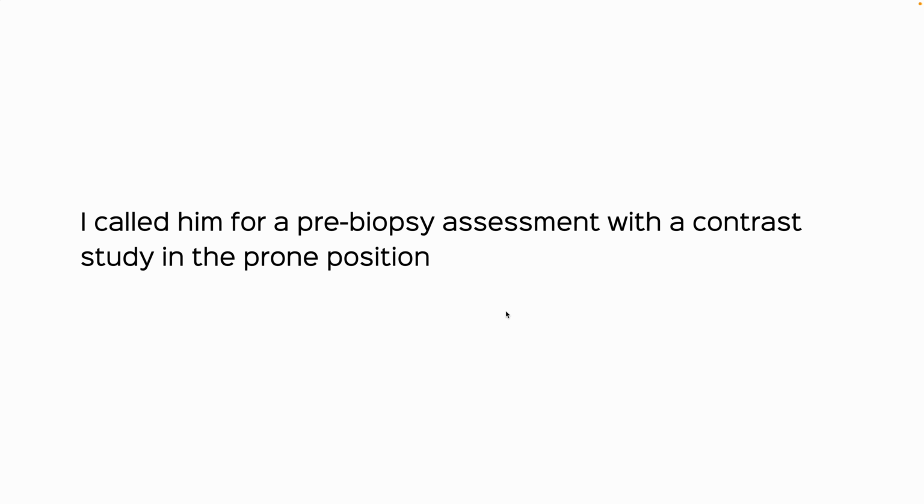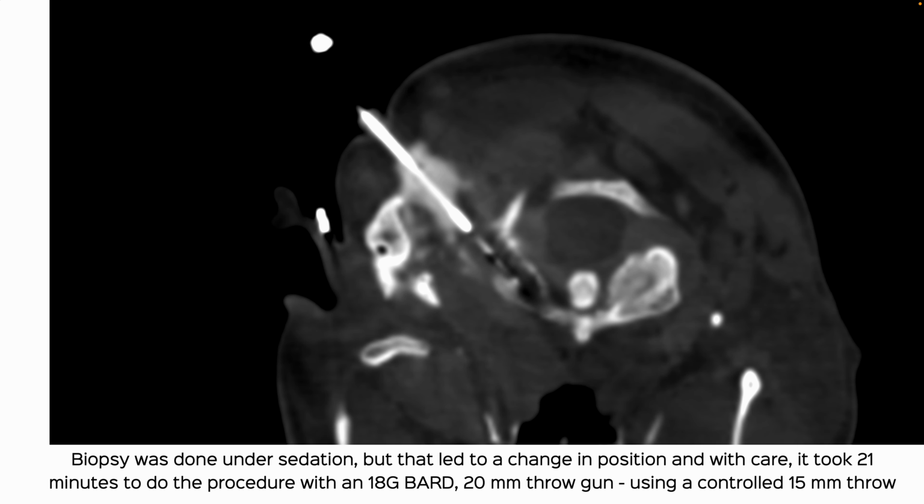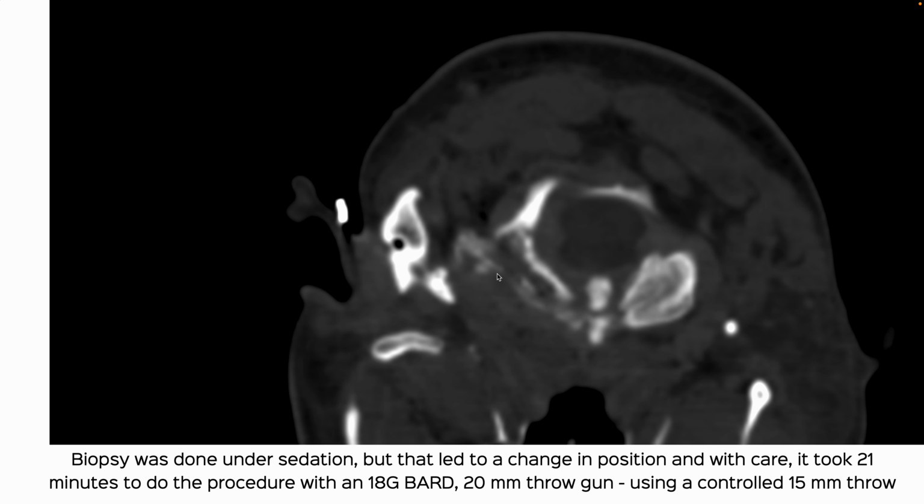So that's what I did using an 18 gauge barred needle. I was able to maneuver the needle into this osteolytic portion, deployed the gun, biopsied it. I did give contrast a couple of times to make sure that none of the vessels was involved. And while the throw is 20 millimeters, I controlled it to about 15 mm and did the biopsy. Got 4 cores, 2 for histopath and 1 each for gene expert and culture, but couldn't get material for aerobic or fungal.